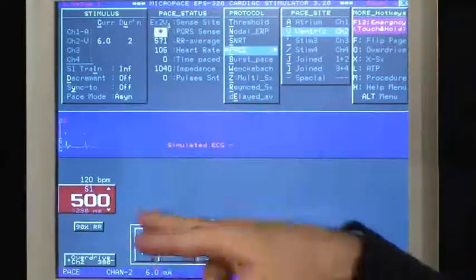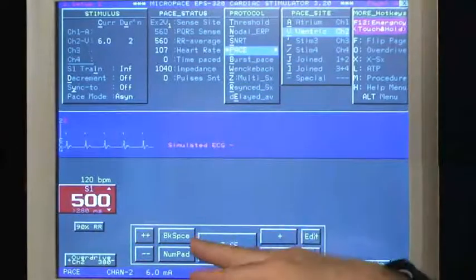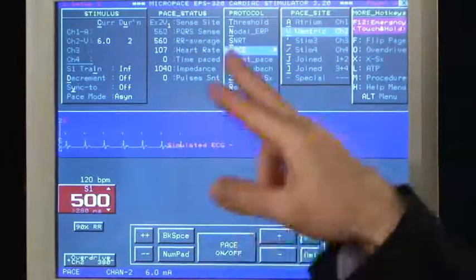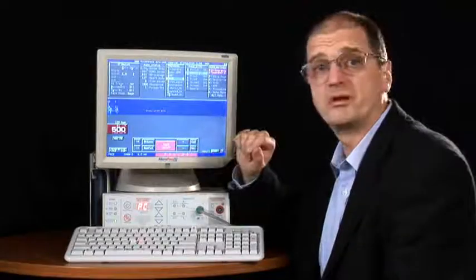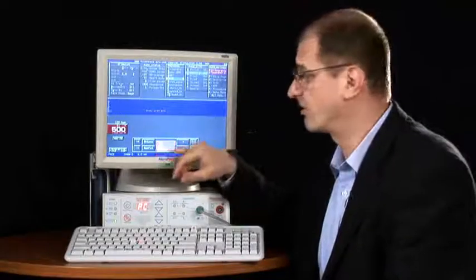At the bottom are various control buttons for modifying the parameters, including the pace on-off button.